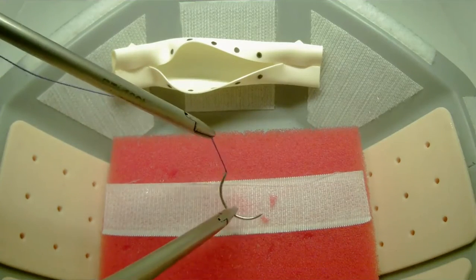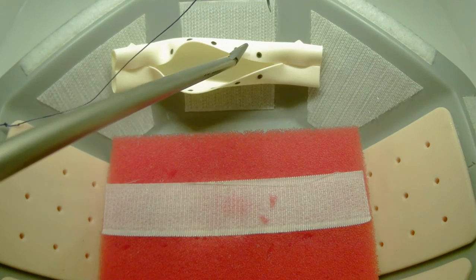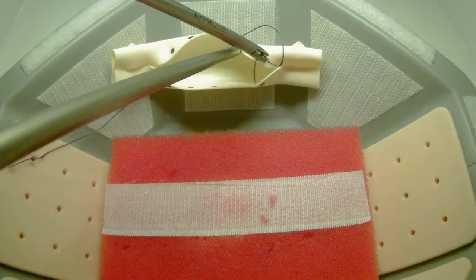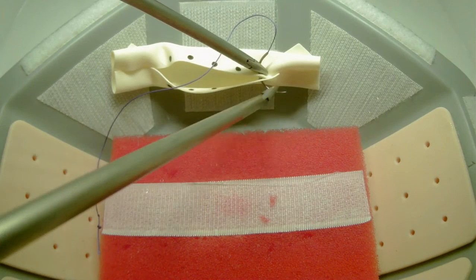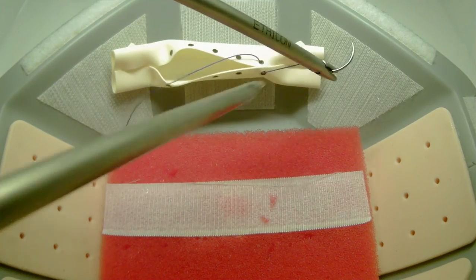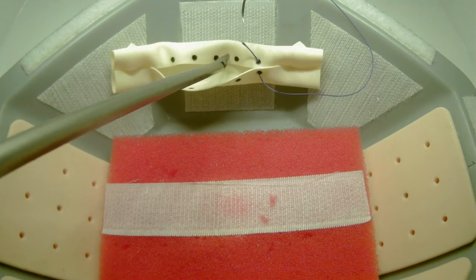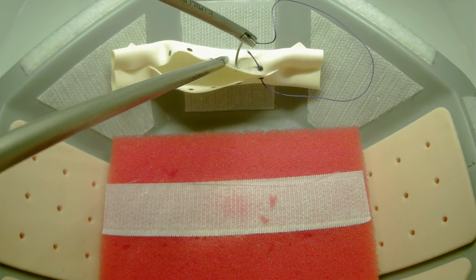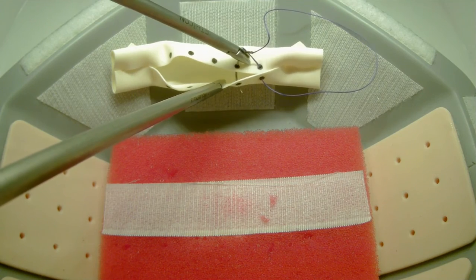Timing begins when an instrument is visible on screen. You should introduce the suture into the trainer holding the suture and not the needle. You will pass the needle through each pair of marks on the penrose drain. The marks are positioned on both the inside and outside of the penrose for reference and ease. The anchor knot should be pulled up against the first target that you pass your needle through, taking care not to pull the anchor knot through the penrose. You will continue running your suture, passing the needle through each pair of marks.